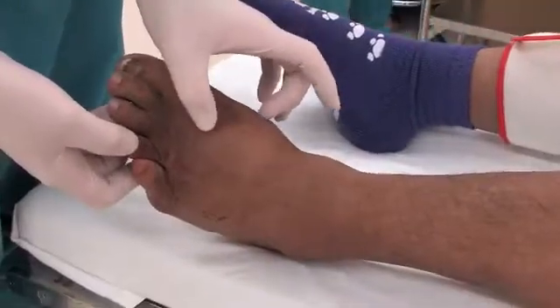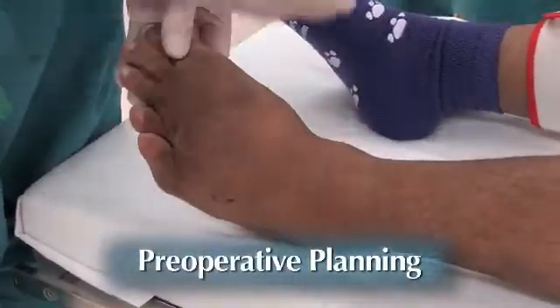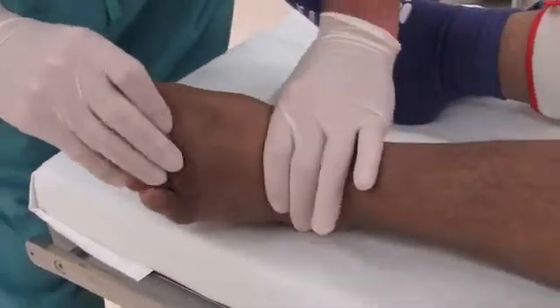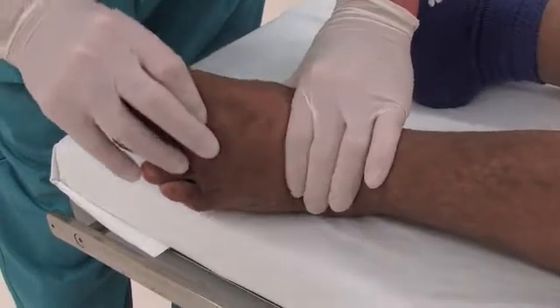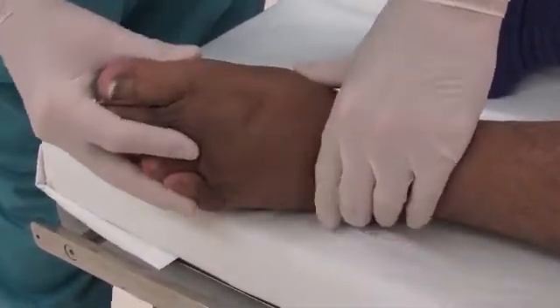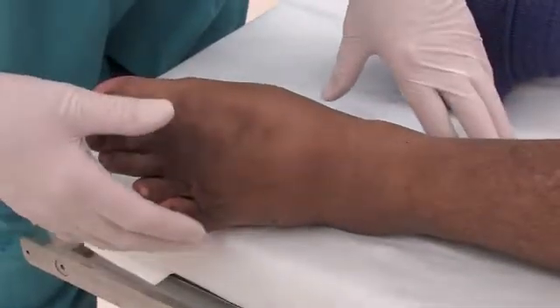Clinically, you can see the dorsal hump here. This is the dislocation dorsally. He has a minimal lateral to medial displacement. From a motion aspect, there's a lot of crepitus and excessive motion here that we're going to try to reduce by adding the circular frame.